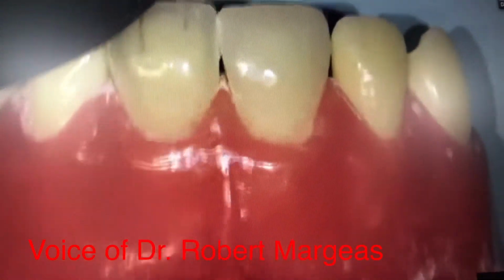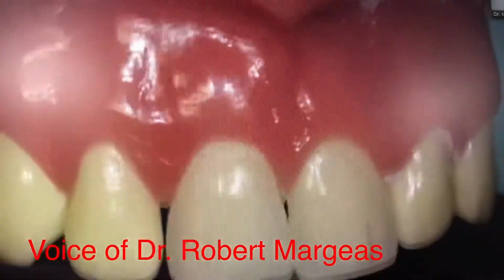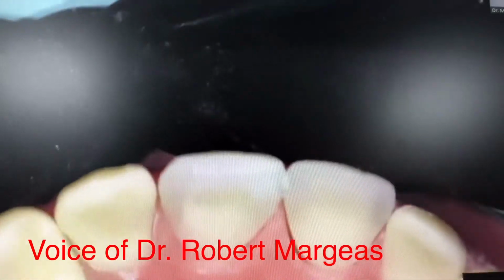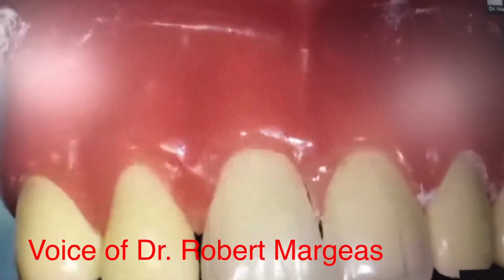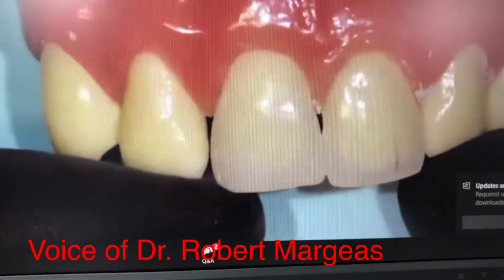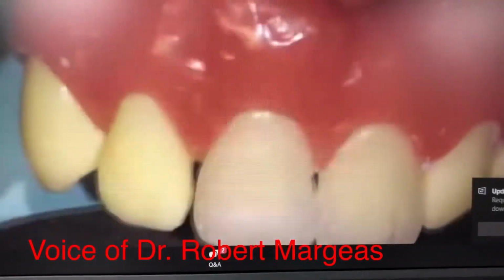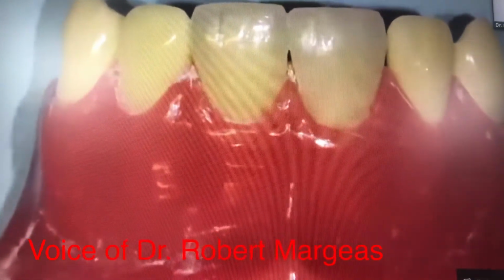Wipe that off. So that's just using the discs and the polisher, okay, with no enamelize. And you can see the anatomy, okay? They're very, very small. See, I do not like this tooth, that developmental depression like that. So what I want to do is this. I'm going to show you how to create surface texture that really matches a tooth a little bit better.